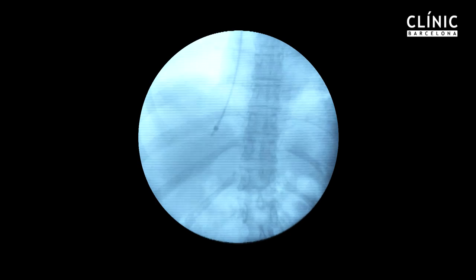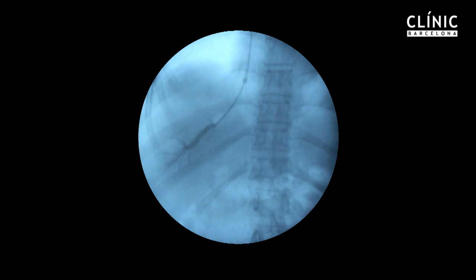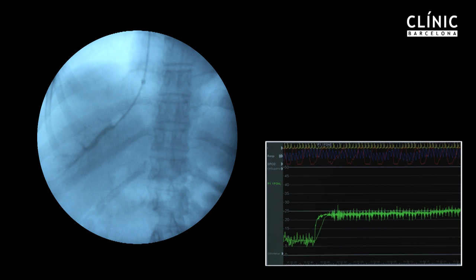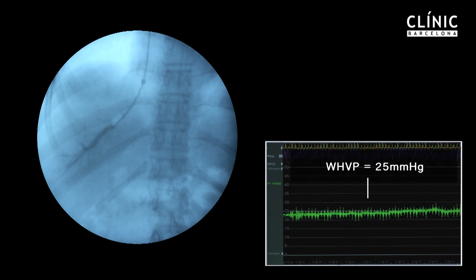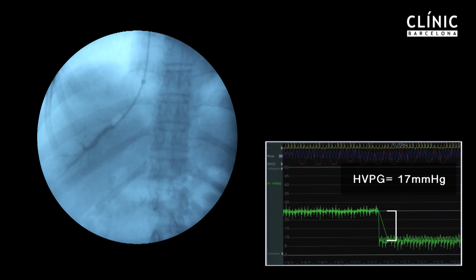Adequate occlusion of the hepatic vein is checked by the slow injection of a small amount of contrast dye. With the balloon inflated, the pressure gradient is determined as the difference between the free hepatic vein pressure (deflated balloon) and the wedged vein pressure (inflated balloon). In this patient, the hepatic venous pressure gradient is 17 mmHg. All measurements are performed in triplicate.